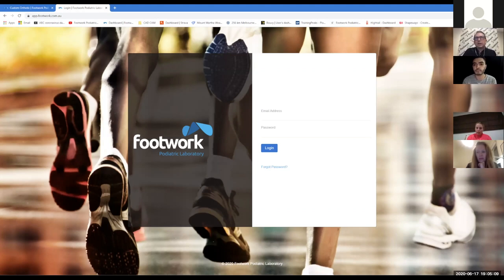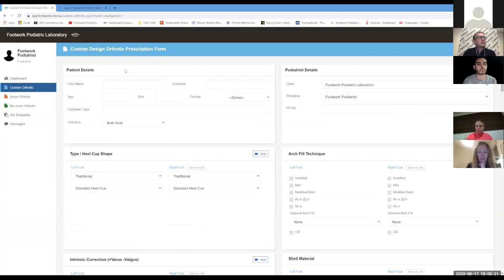The topics we'll be covering today — let's start with the basics. On our portal, the scan I'm using is from a footwork podiatrist perspective. I've just scanned one of my sons — he's been waiting six months for orthotics. So we finally scanned him. Patient details include first name, surname, age, shoe size, gender, and footwear type.